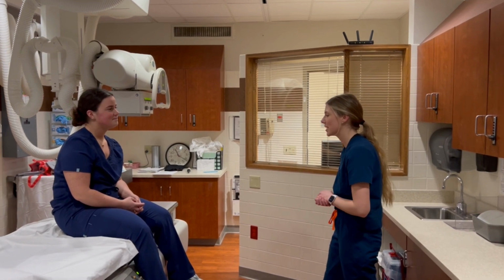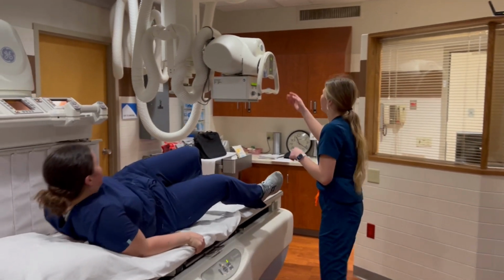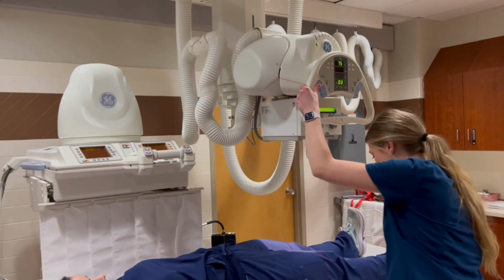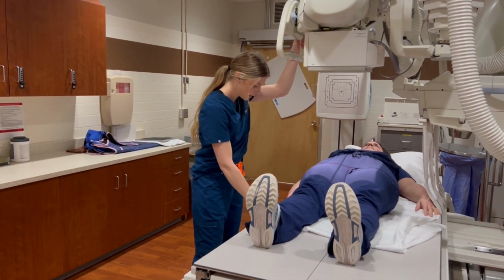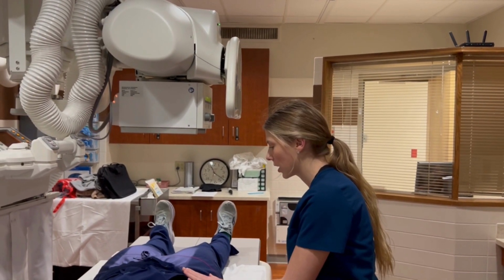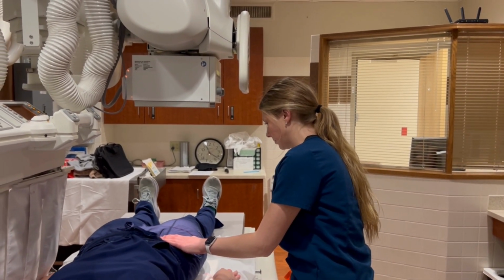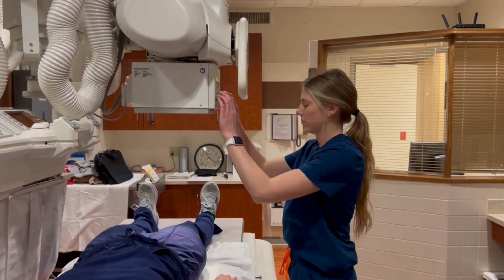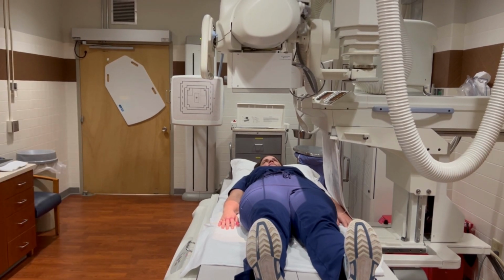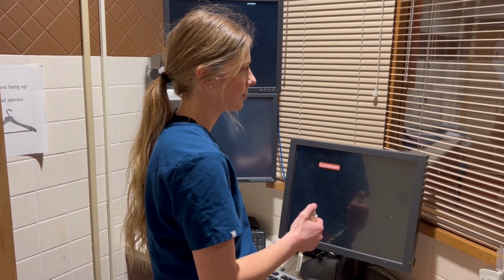Alright, Ms. Jackson, so we're going to be taking x-rays of your right hip, so I'll have you lie on your back, relax your legs. This tube is going to be coming above you. Alright, the table's going to be moving. I'm going to be poking in your hip a little bit. Alright, just hold still. Freeze.